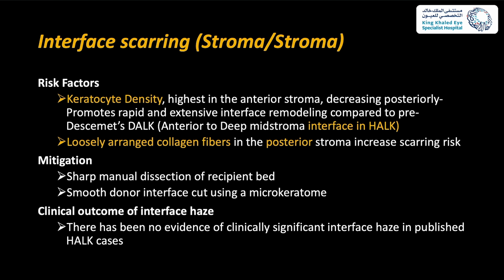How can we mitigate those 2 factors? First, the sharp manual dissection of the recipient bed, as well as the smooth donor interface cut using a microkeratome, would allow better interface alignment and reduce the risk of scarring. And there has been no evidence of clinically significant interface haze in published HALK cases.